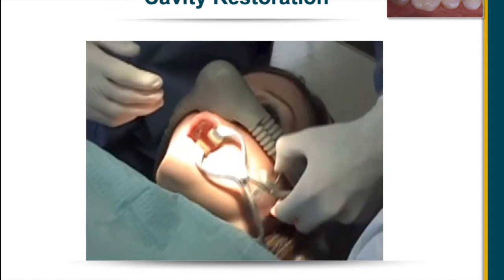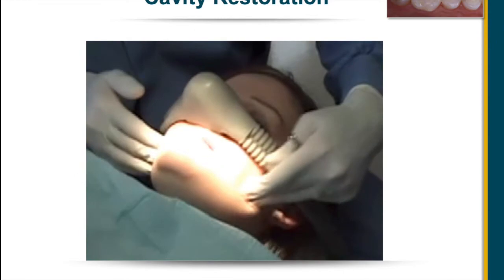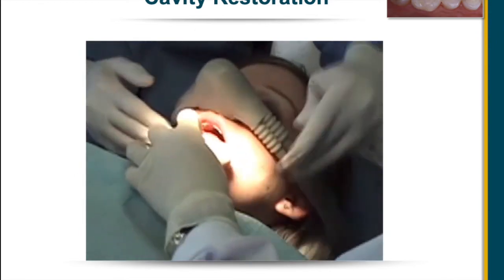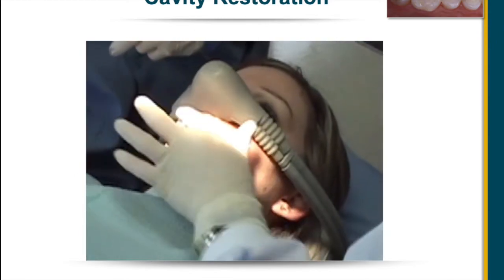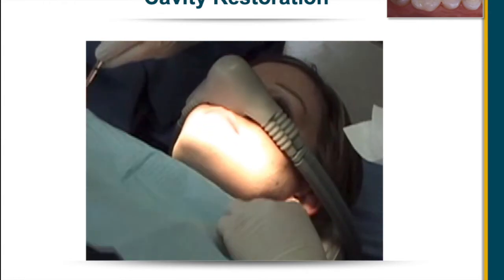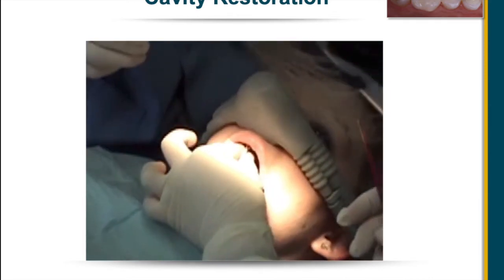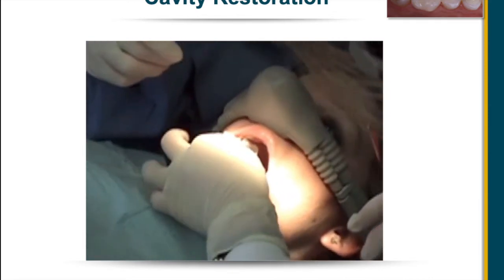The majority of the procedure is now completed and the doctor prepares to adjust the occlusion for the patient. The prop is removed and a gentle massage of the patient's masticatory muscles is given, some Vaseline applied to the lips, and the patient's comfort is, again, first and foremost throughout the procedure.